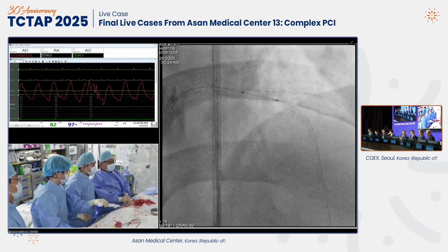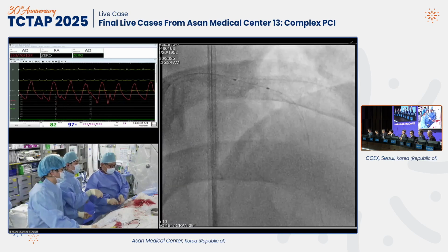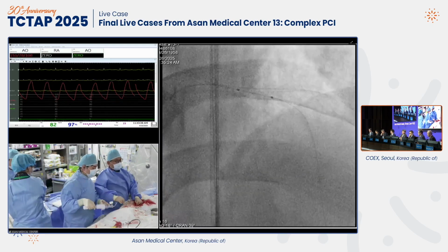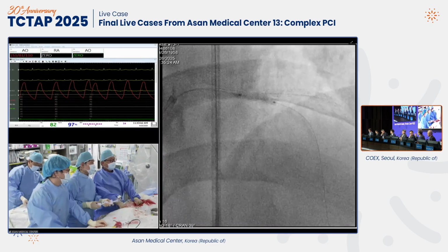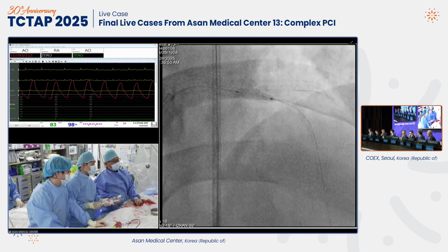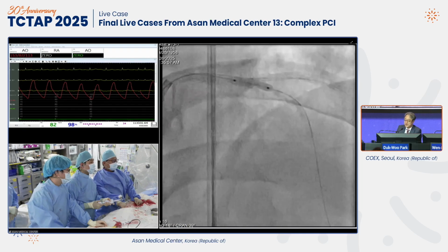Particularly in this case, the very calcified side branch ostium, if the stent is underexpanded, 10. If you crush the 2.5 side branch, sometimes rewiring the side branch is so difficult. 18. Yeah. A much bigger side branch is okay, but this is 2.5, sometimes very difficult.